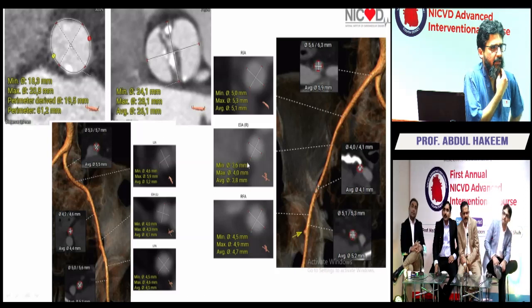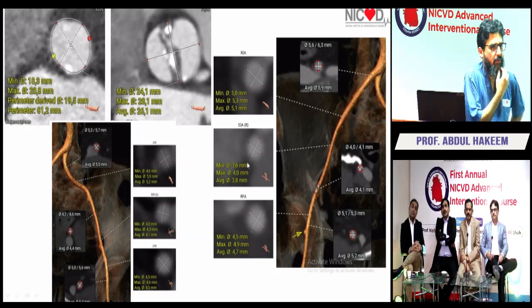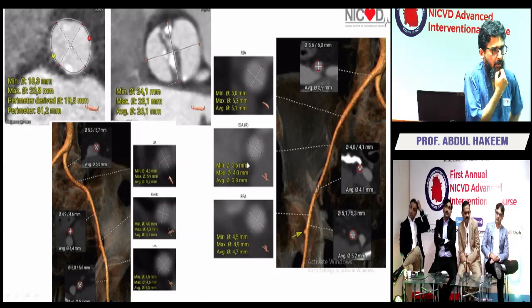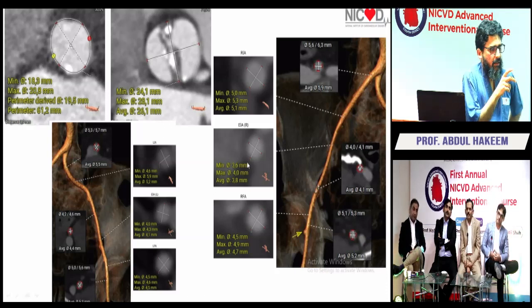Okay, so you guys understand the point that Dr. Khan just said about closing the artery with pre-close. I've had it happen at least 4 times in my career, and it's the nastiest thing. Sometimes, even when the vascular surgeon goes in, he can't find the lumen, because the way that happens is typically when you take a bite, you want to have anterior stick under ultrasound guidance. You want the foot plate to be absolutely parallel to the artery, and you take one bite.